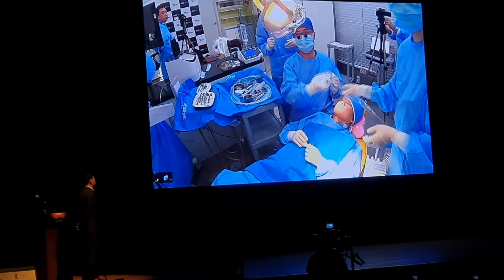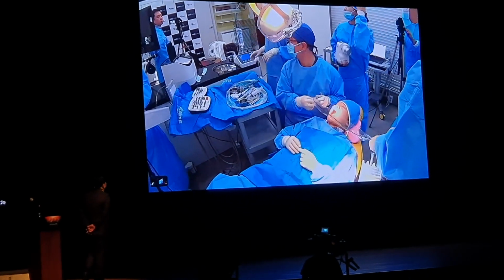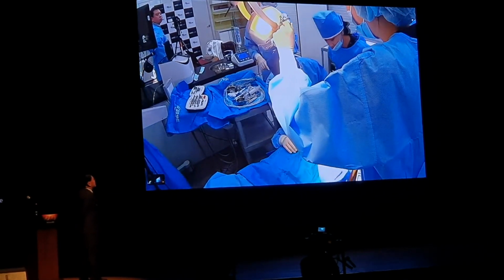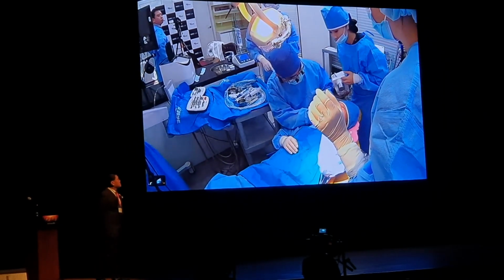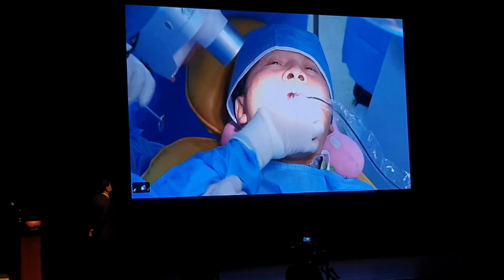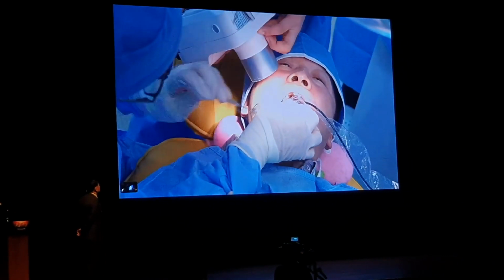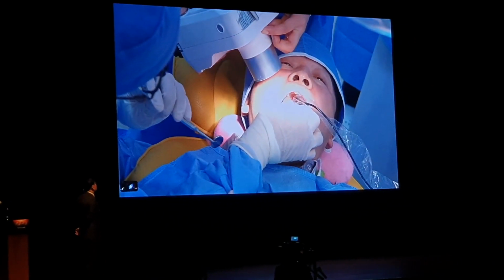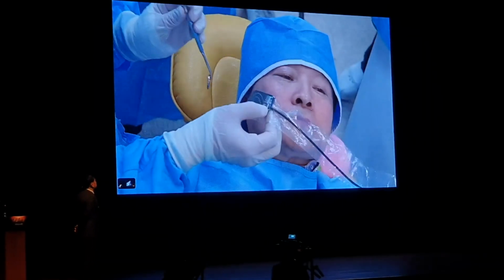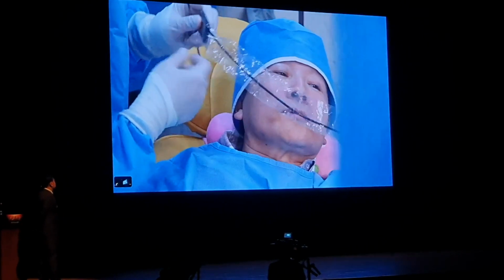So now, can you take a periapical radiograph from here? So we'll now take a periapical radiograph. The time? Let's see. I was standing right beside you. 38 minutes have passed. 38 minutes and 30 seconds. The palate isn't deep enough for the film.